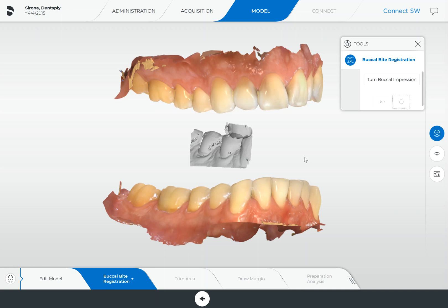Because at times this will happen. Primarily it happens when you didn't acquire enough information in the acquisition phase in your buccal bite catalog in order for the software to put the models together for you. So the first step would always be to go back to acquisition and scan a bit more in the buccal bite catalog until you actually get a green check mark. Once you have that green check mark in the buccal bite catalog under acquisition, you won't have to do this step.